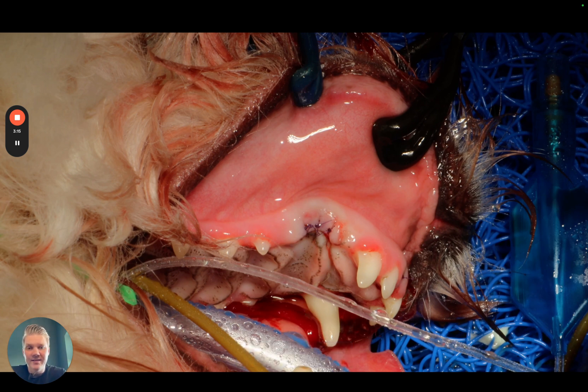So for selected cases, especially small to medium sized dogs, you can absolutely do flapless extractions on canine teeth, because the roots are kind of straight. You can see here how easy it was. Let me know what you think, and share this video with a veterinarian who wants to speed up their extractions.